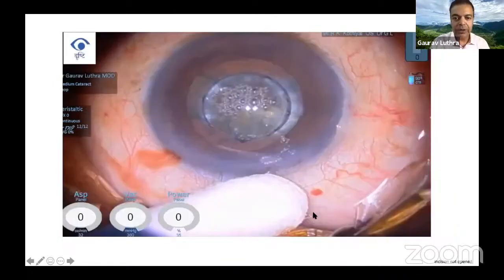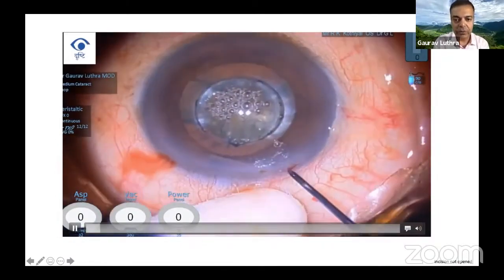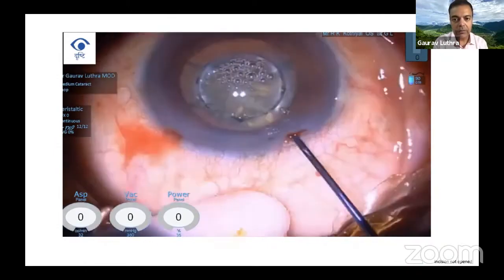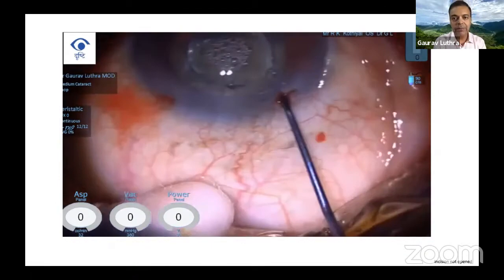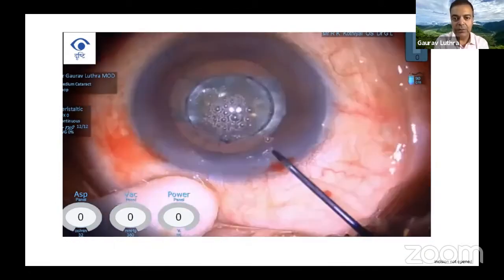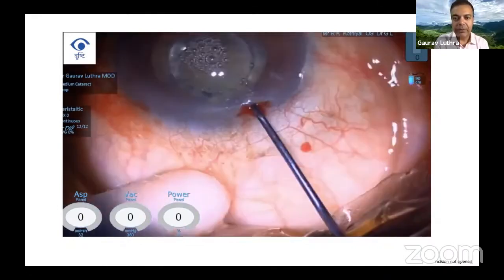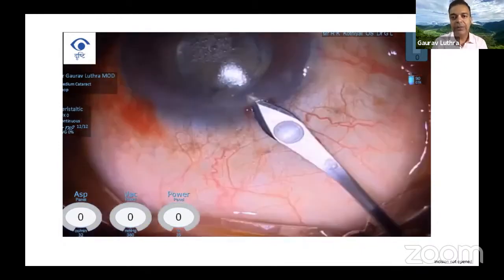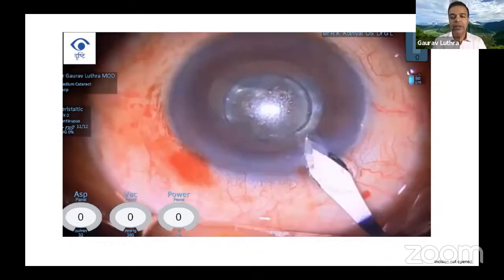So going on, there was another situation here where we made a femto incision, and I'm going to try and open that. You can see that sometimes these incisions will not open as you would like them to. And even though I've got into the correct plane, you can of course go wrong with the planes and so many other things. And then you can sometimes have to actually complete your incision. And these are the cases where you may actually have a poor entry wound.